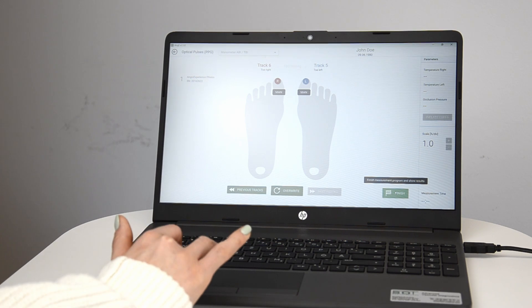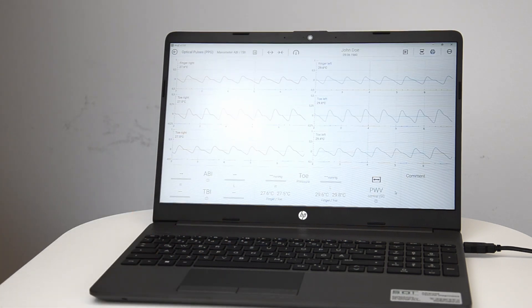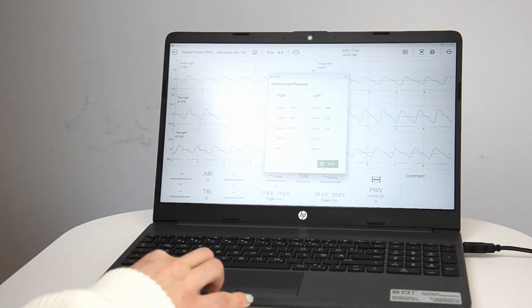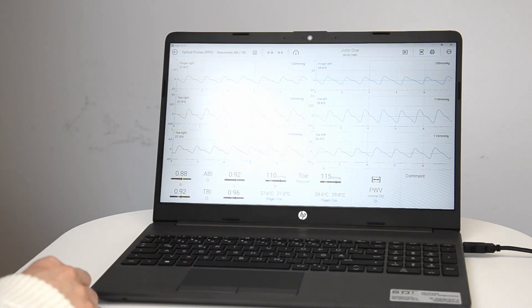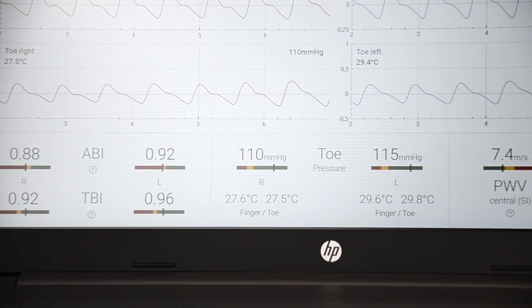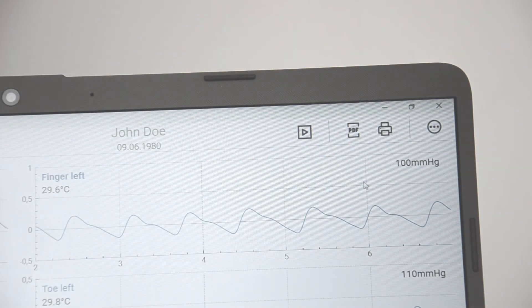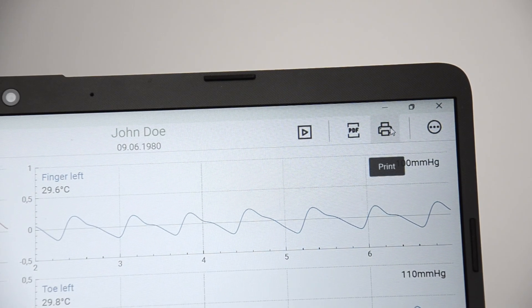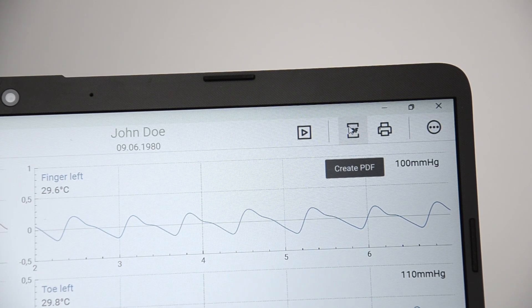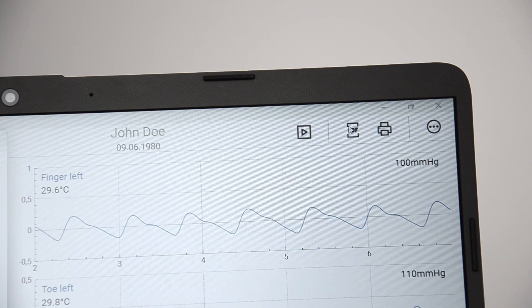Once completed, finish the measurement and enter the marked pressure values into the software. The results are calculated automatically. You can directly print the report or export a PDF document. Optionally, a DICOM or HL7 interface can be configured.